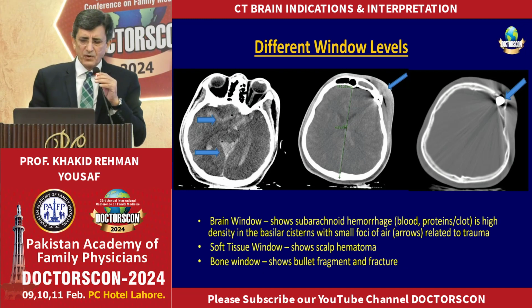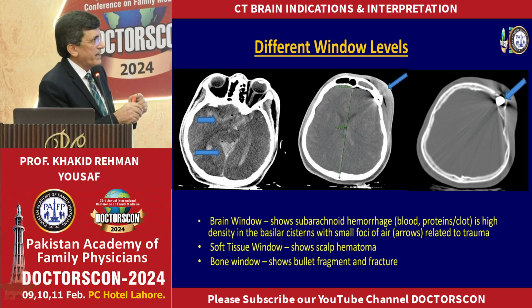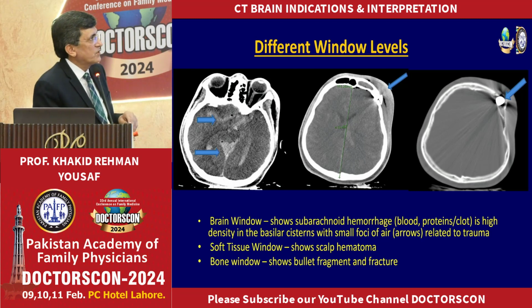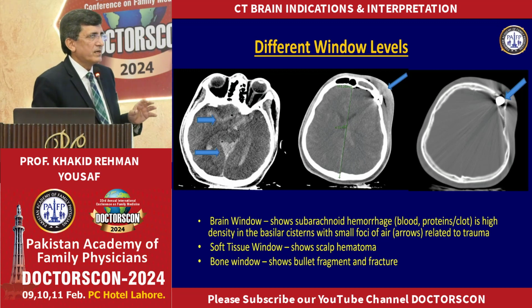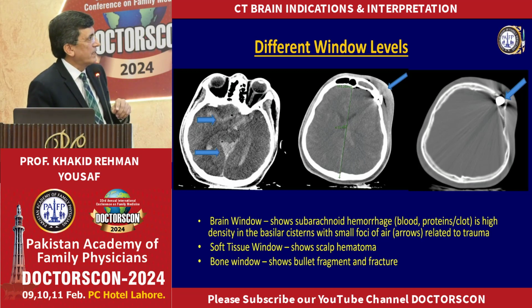A few words about windowing levels. These are certain parameters which have to be adjusted in the machine, and the computer adjusts them, because when the technician is scanning, whatever we are aiming at, either a stroke, or ischemia, or suspecting a bleed, we set a certain window level to see that with clarity. Do we see the hyperdense area in the brain?